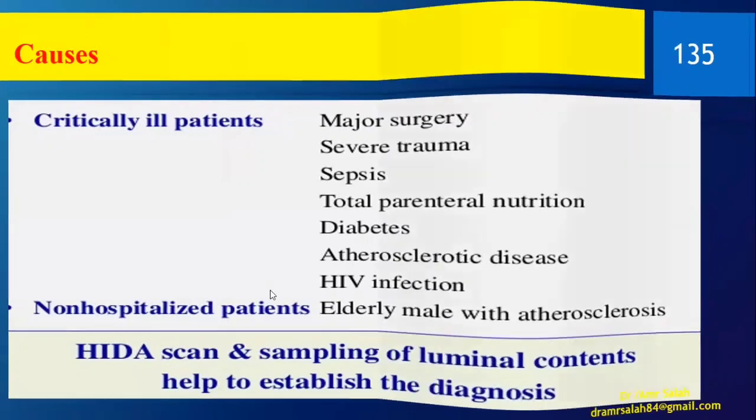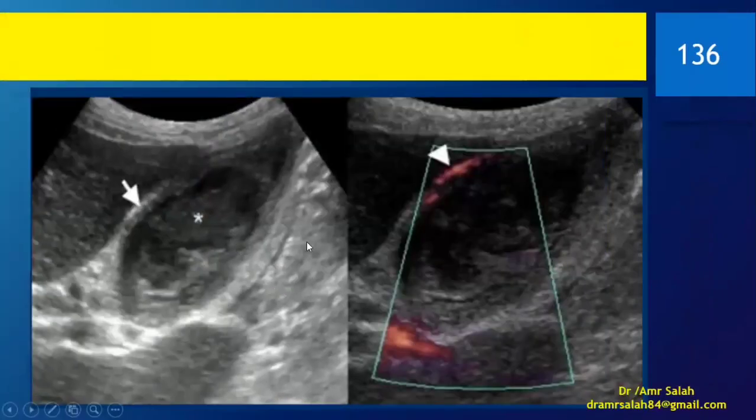Okay, so this patient is very different from the one that's young, that's healthy, but he's in pain and suffering from pain in his right upper quadrant. This is the patient with the stroke. But this patient is different. This patient is ill. He has a major event.